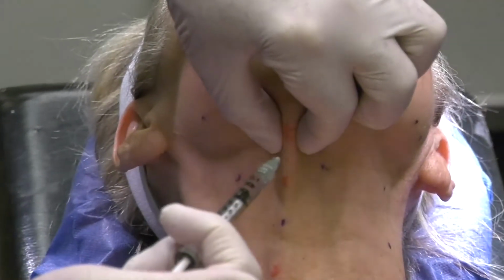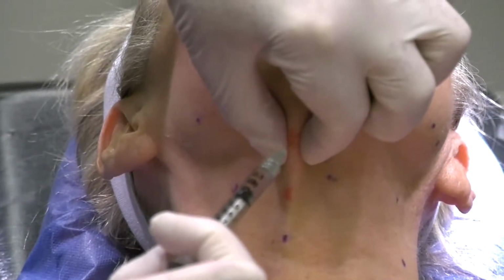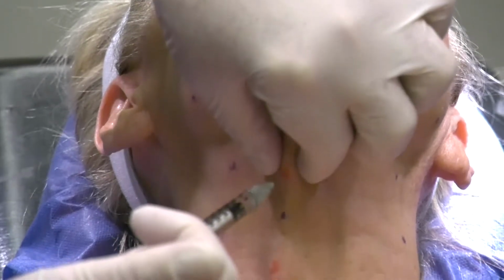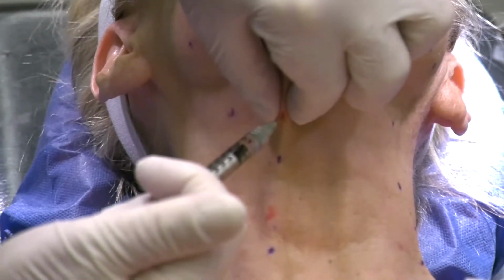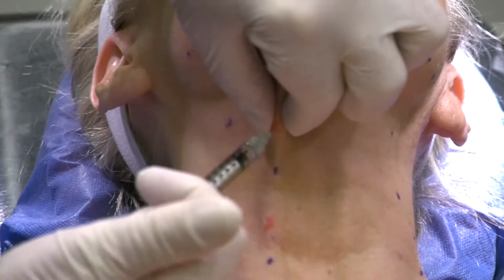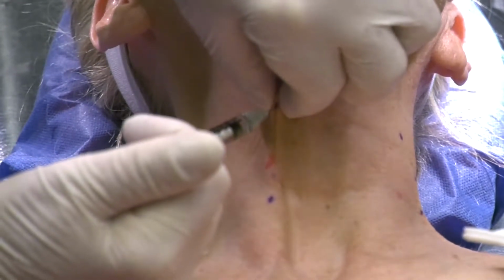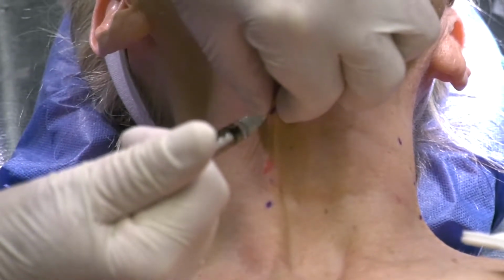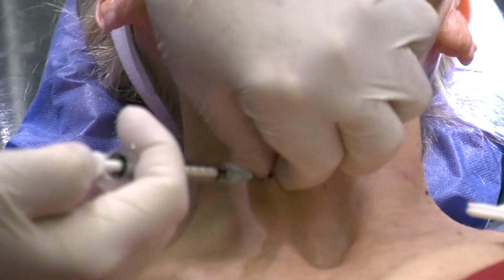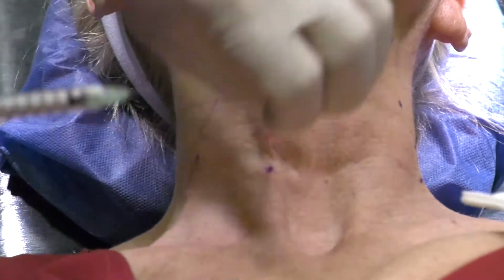Now this is a 4-unit injection, so it's a 0.1 cc injection at this dilution. Again, another 4-unit injection, which is 0.1 cc injection, spaced with a 2-unit, which is 0.05. And again, 2-unit. May I have the next one?